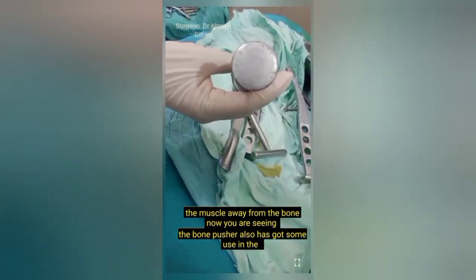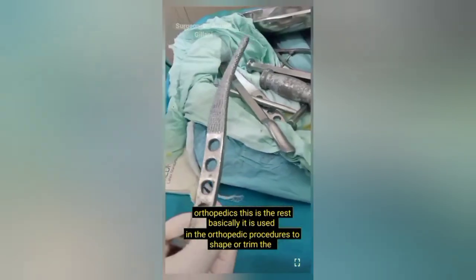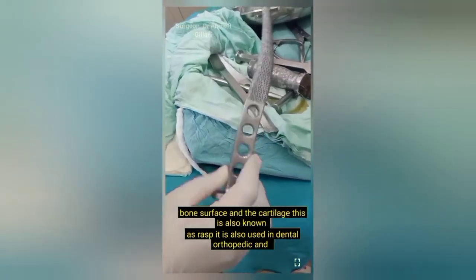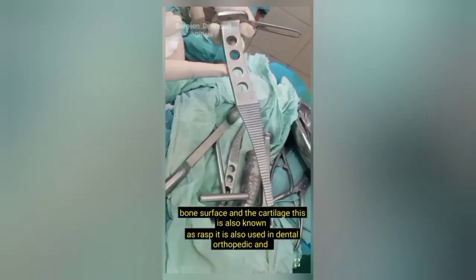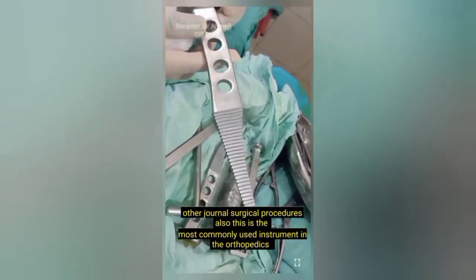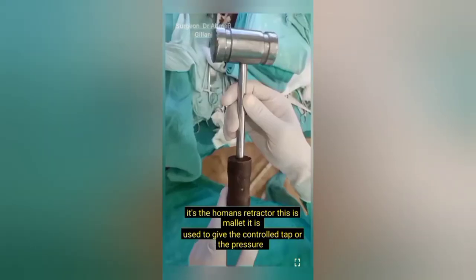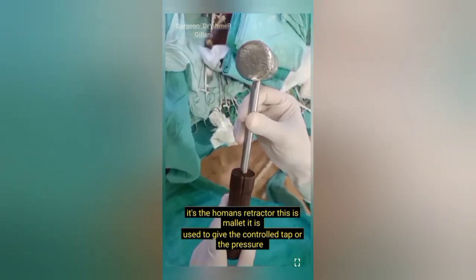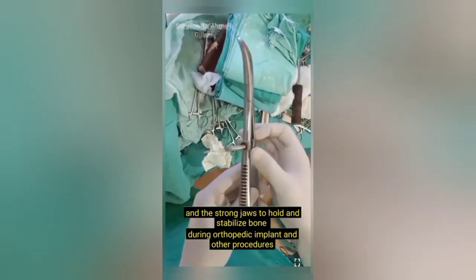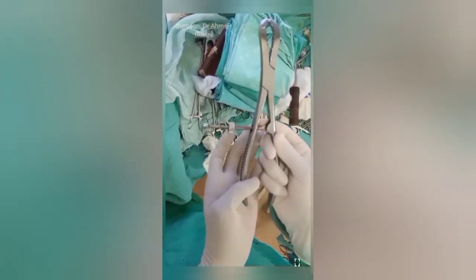Now you are seeing the bone pusher, which also has uses in orthopedics. Next is the rasp, basically used in orthopedic procedures to shape or trim bone surface and cartilage — also used in dental and other general surgical procedures. This is the most commonly used instrument in orthopedics, the Hohmann retractor. Next is the mallet, used to give controlled taps or pressure on the chisel or osteotome. Then you are seeing bone holders, which have long shanks and strong jaws to hold and stabilize bone during orthopedic implant and other procedures.